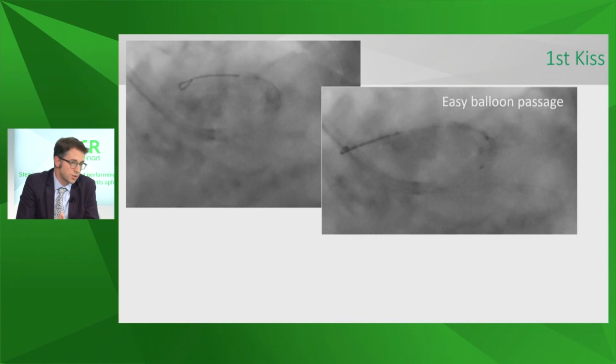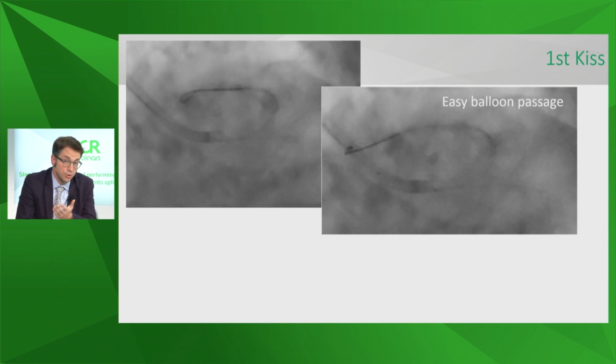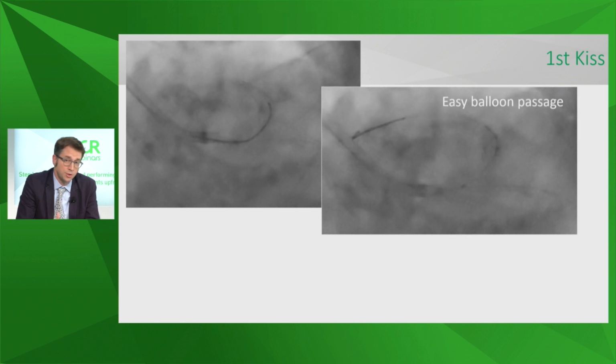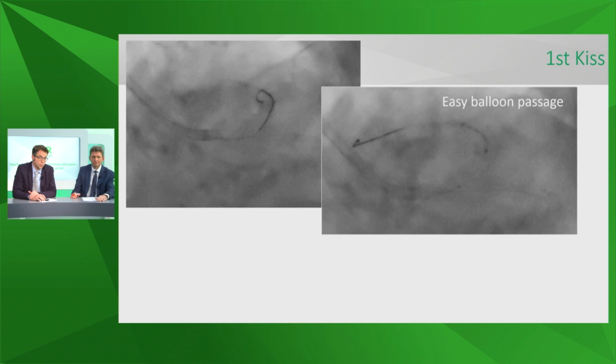So, successful recrossing through a middle cell. Next step, please. So we say successful. We're looking at the angiogram. We can't be absolutely sure, and I think you could re-image to check the passage, and there are some studies ongoing looking at wire crossing. The fact is, I often use just one of my used balloons and see how it passes, and you'll know very quickly if you've gone under a proximal strut, because the next device won't pass, and you see very nicely here the balloon passing smoothly.